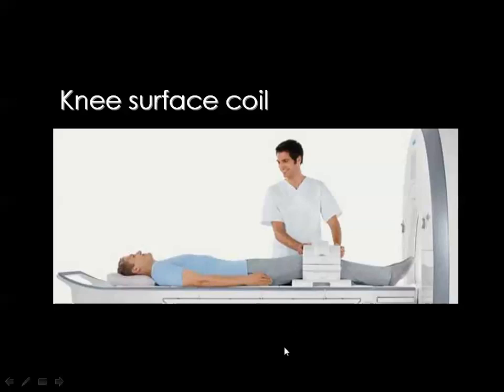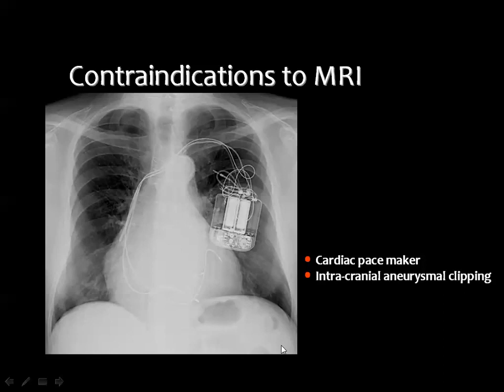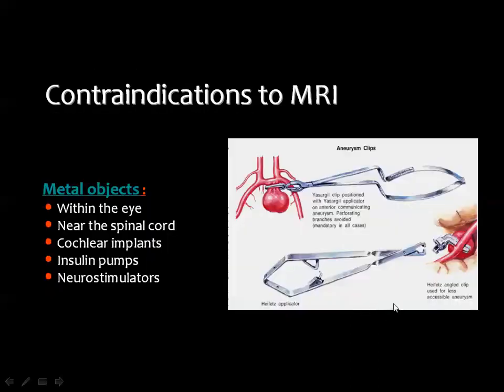if it is available. Then some contraindications were present at the beginning era of MRI, and this included the cardiac pacemaker and the intracranial aneurysmal clips. For treatment of intracranial aneurysm, you just put a metallic clip on the neck of the aneurysm and you leave it, then the blood will clot inside the aneurysm and you get what looks like a simple management of the aneurysm.